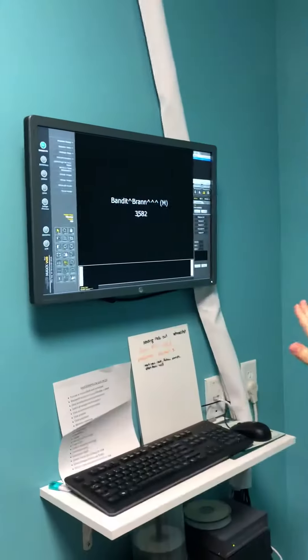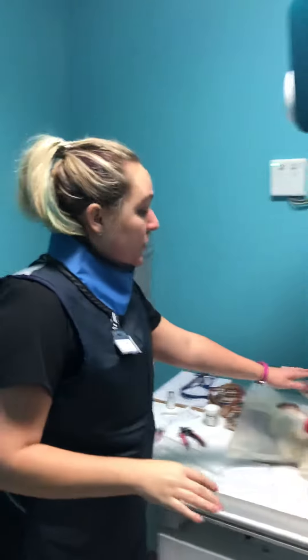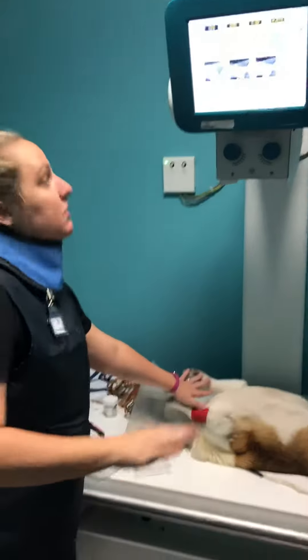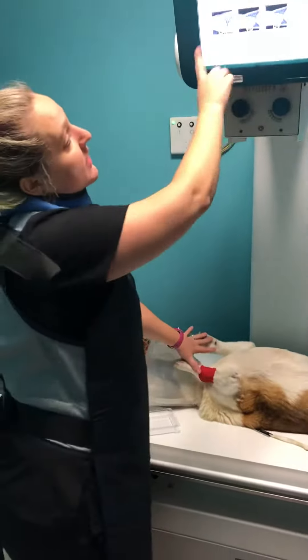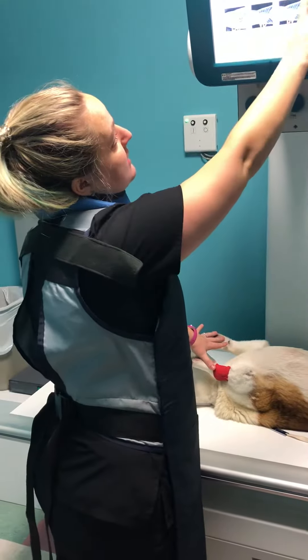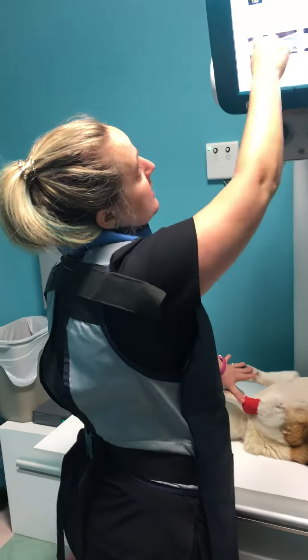We have Bandit put in the system. We are going to go ahead and do a thoracic radiograph on Bandit. We measure him at 18, and we set our parameters for a VD thoracic at 18.